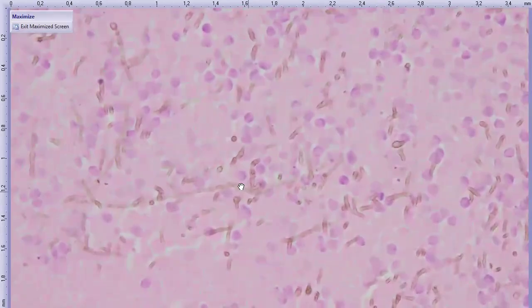They are already sort of brownish, brown to amber, I would say, which helps distinguish them from the background. And what do they look like? They are linear structures, they're septated, right? And they branch out. These are fungi, beautiful fungal hyphae.